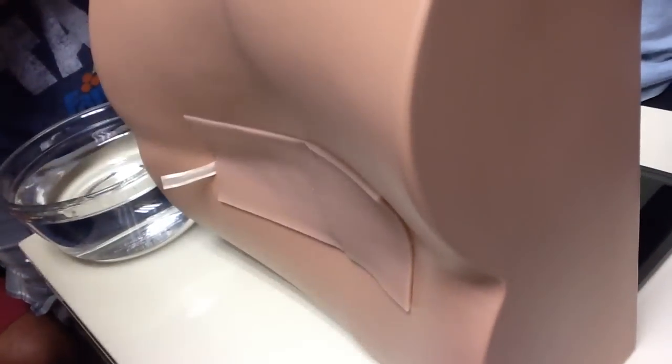It's got a digital meter which tells us the CSF pressure. This patient is in the left lateral recumbent position. The touch and feel of the mannequin is almost like that of a normal human. This is the spinal insert — you don't have to see what is inside. Inside there is a tube which contains the CSF, so-called CSF.